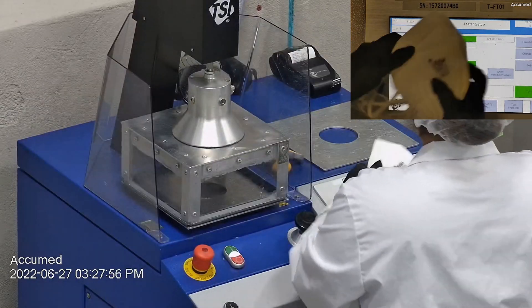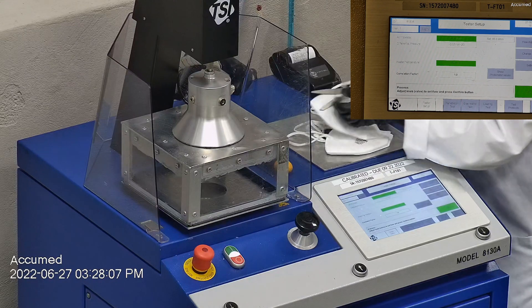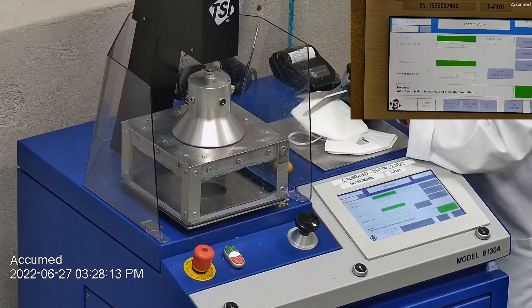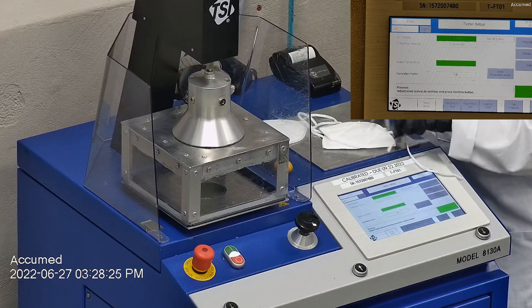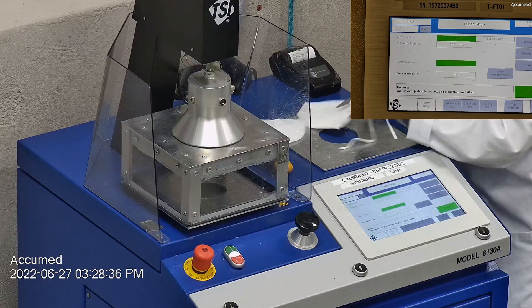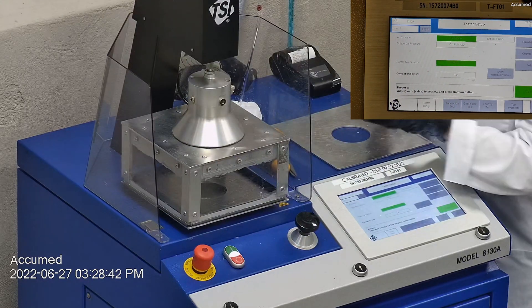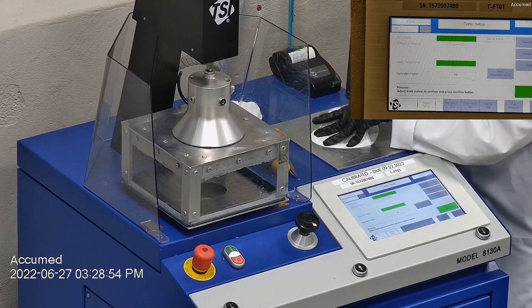Let's go ahead and see how these test on our TSI machine. We're going to be testing both the filtration efficiency and the pressure drop. This is our TSI machine 8130A, which is also the same filtration testing machine that NIOSH uses to approve N95 respirators. Our procedure is inspired by NIOSH. We first run a tester setup and start by removing the headband from the respirator before placing it onto a testing plate to ensure a proper seal.